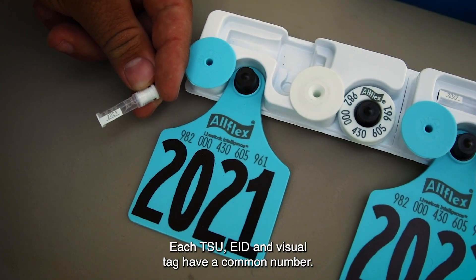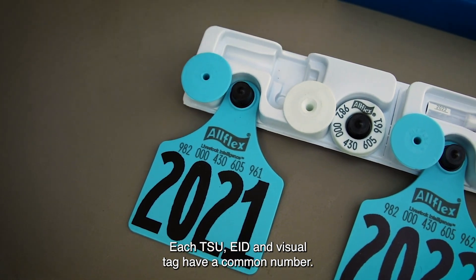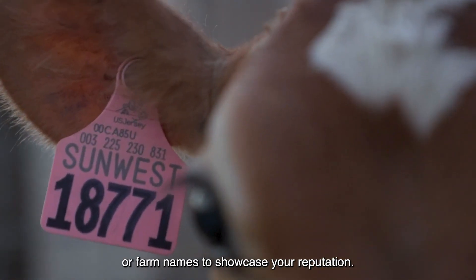With matching sets, each TSU, EID, and visual tag have a common number. Customized visual tags can also be printed with logos or farm names to showcase your reputation.